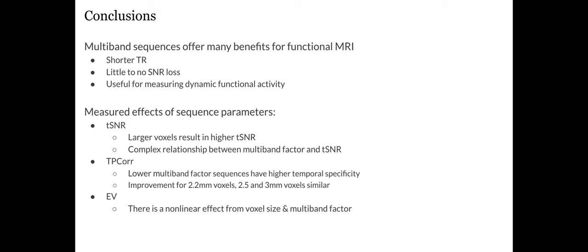I have a question. You said that you expected the SNR to be higher with a larger multiband factor. Can you explain why? So from a paper that we read, the paper essentially said that there would be a square root of N increase.